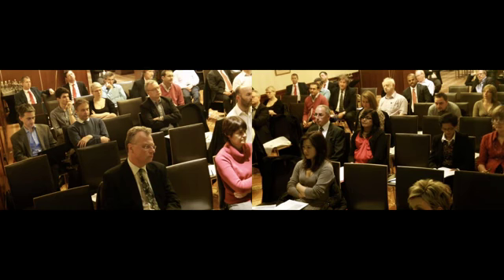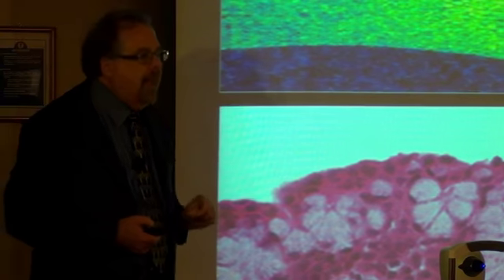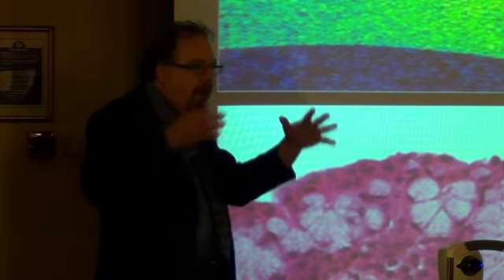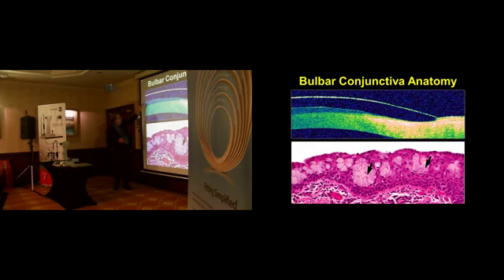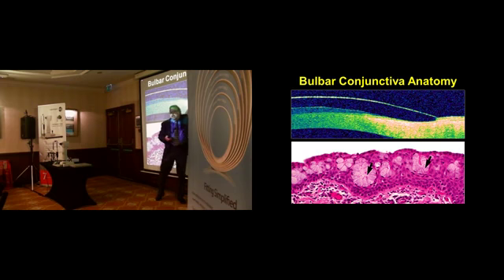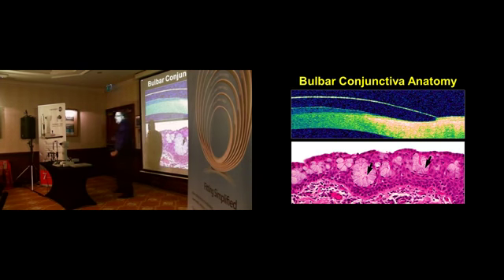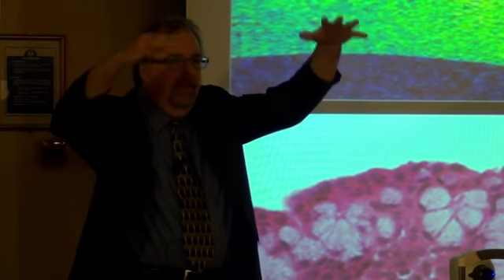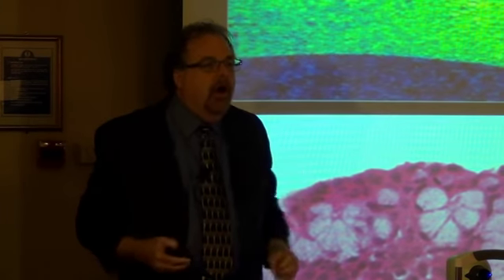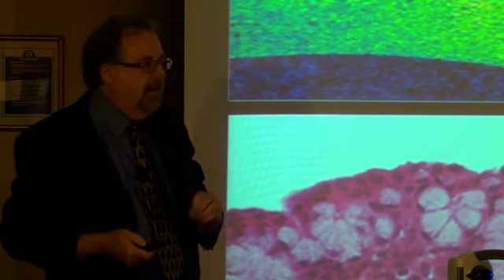But there's a method to the madness, and that is when you have a modality on the eye that is clearing the central cornea, clearing the peripheral cornea and limbus, and then ultimately landing on the bulbar conjunctiva, there's going to be some rather significant amount of settling of the contact lens on that bulbar conjunctiva.